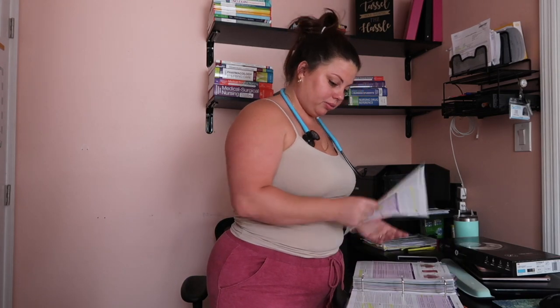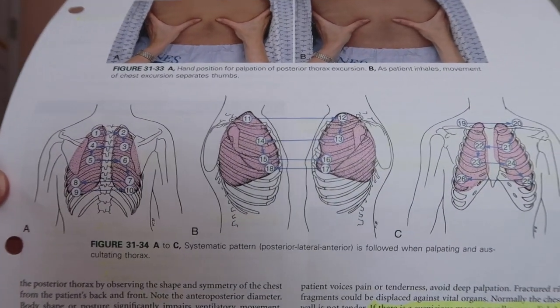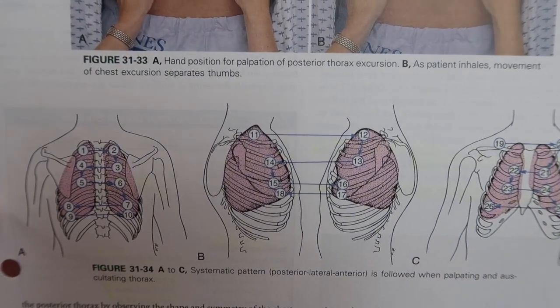I also have this one, which is really good for assessing lung sounds. When you listen to lung sounds, you're going to go over, down, over, down so that you're not missing any part of the lungs. You do the same thing down the back as well. This diagram gives you the numbers and shows you exactly where you should be listening, so pause and screenshot it if you'd like.